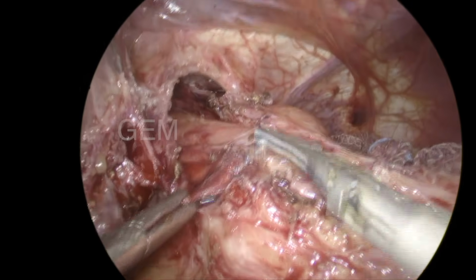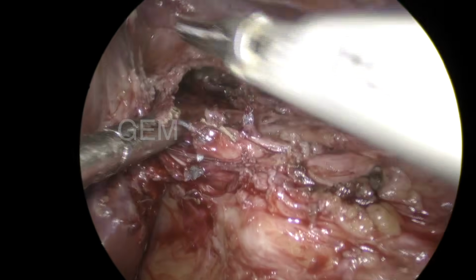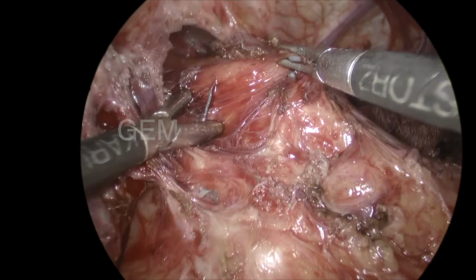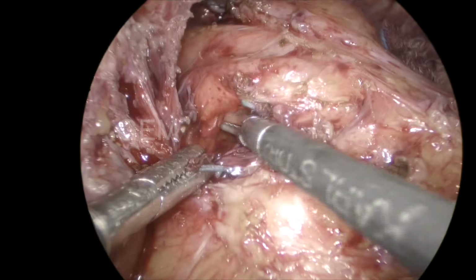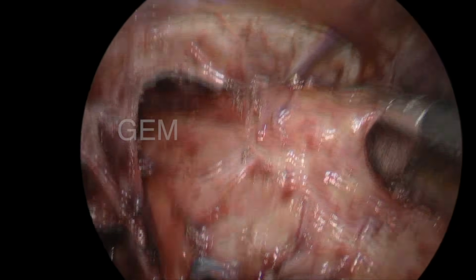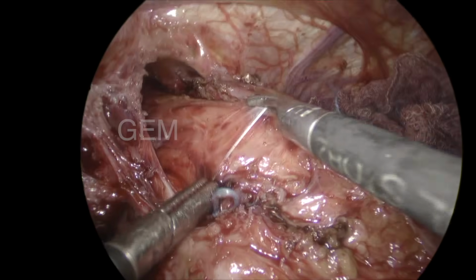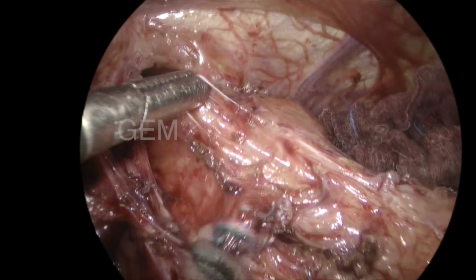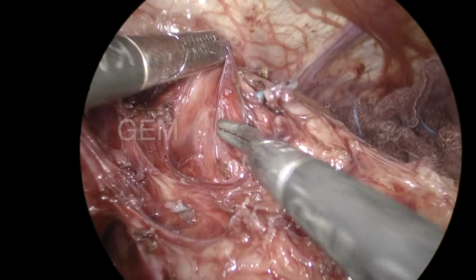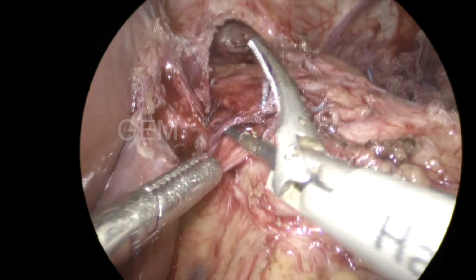That fundus is adherent to the crus, the right pillar of the right crus. Again I am dissecting. I couldn't see the edge of the fundus. If I see the edge of the fundus, I can divide, so I am not able to see. Here also we have to be careful. Anterior dissection, only the mucosa will be there. Now is the lateral side.